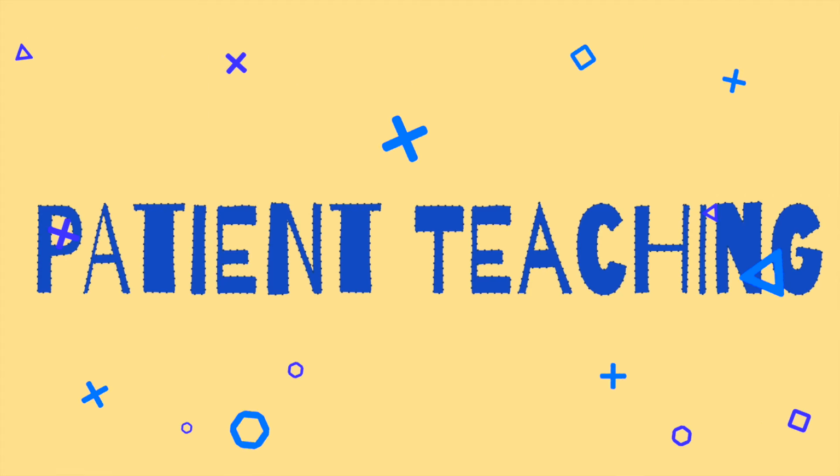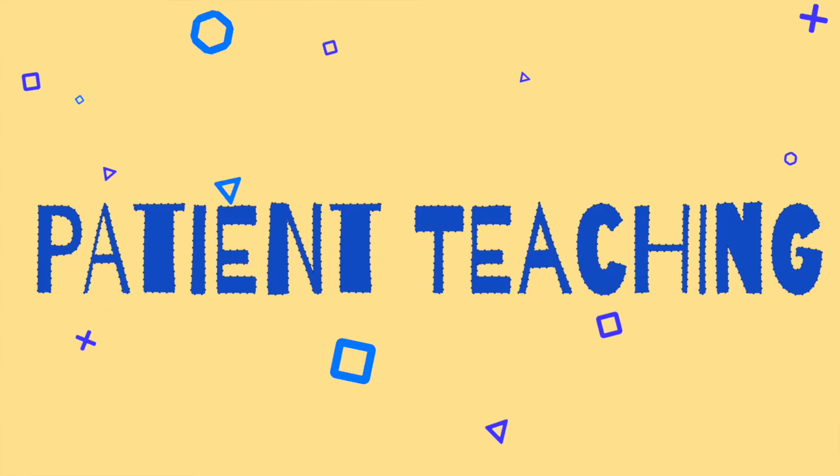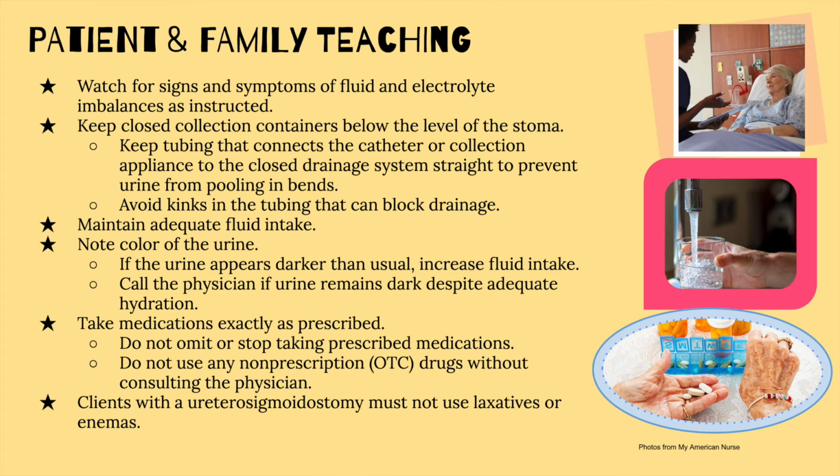So last but certainly not least, we're going to move on to some patient teaching, and then I'll let you guys go. Now this part, the teaching segment, is a little lengthy and highly detailed, but it's very important because effective teaching sets the patient up for success when they are discharged home.